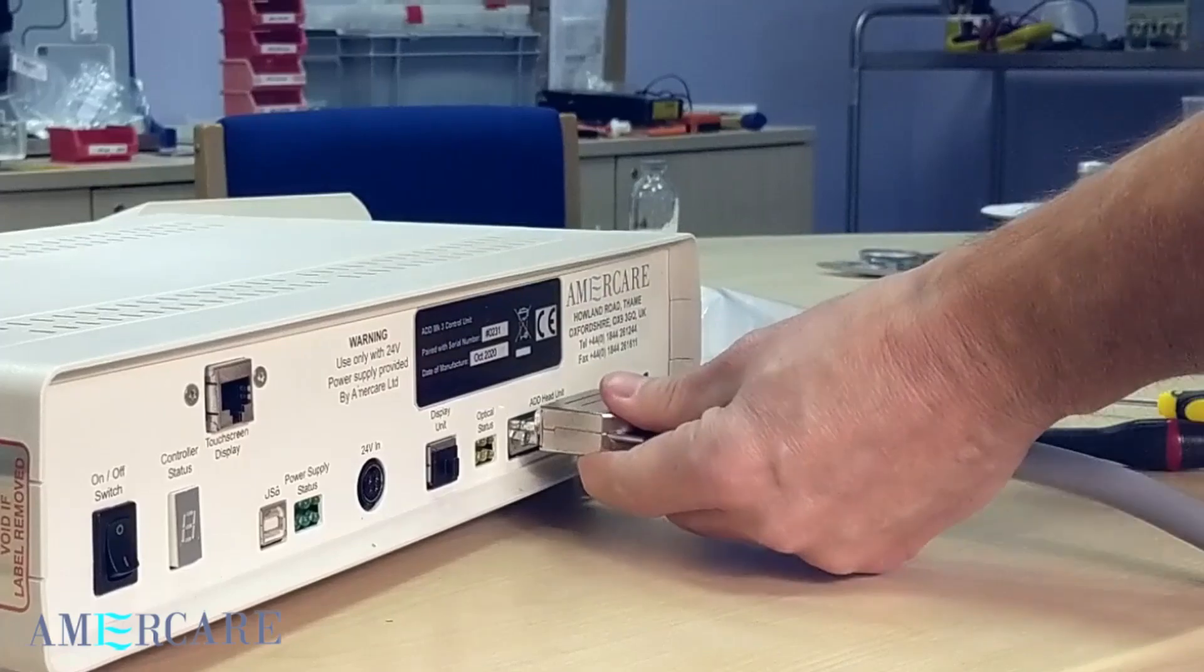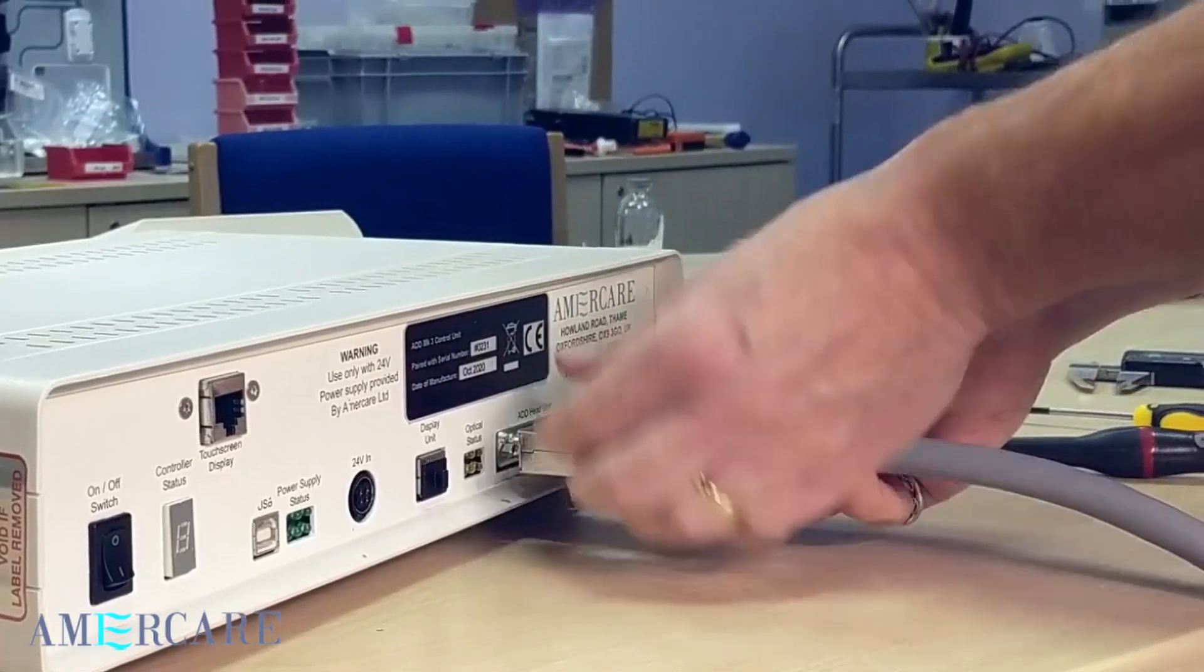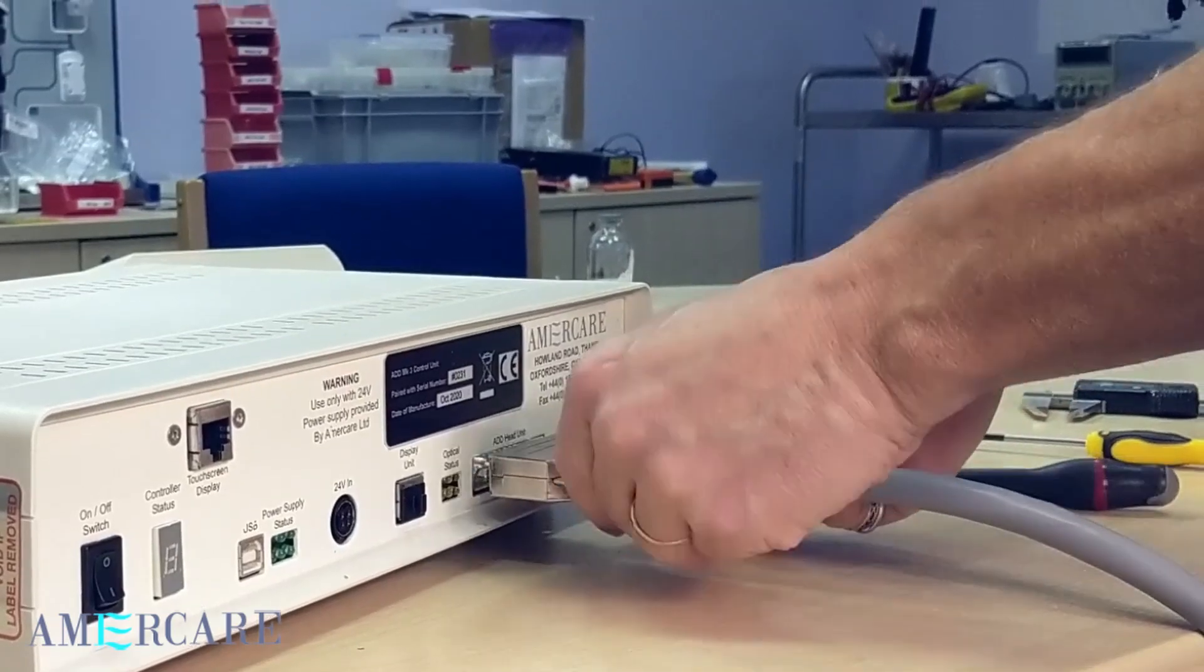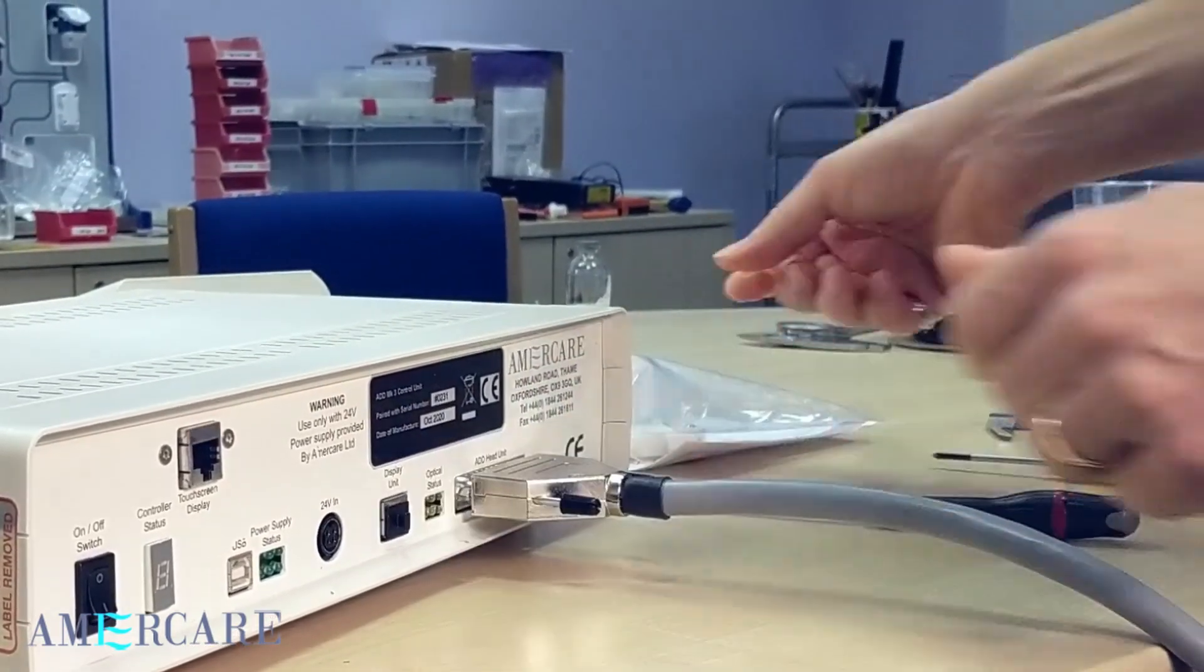To fit, correctly orientate the D connector, align and push firmly home into the socket. Tighten both securing screws to ensure a correct connection is made.